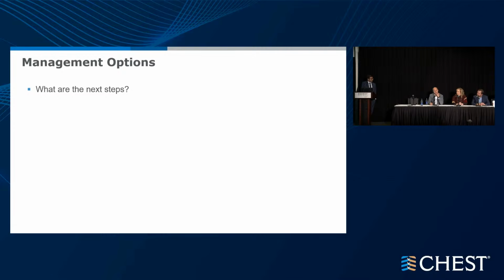The concern is, and we've seen that several times, right? GI goes in, they deploy a stent, and I really don't understand why they place 18 and 20 and 22 millimeter stents when the esophagus is a virtual space, but whatever. So they put these large stents, and then where is that pressure gonna go? It's not gonna go towards the spine posteriorly. It's gonna push the airway anteriorly, the tumor anteriorly, and it's gonna close the windpipe.